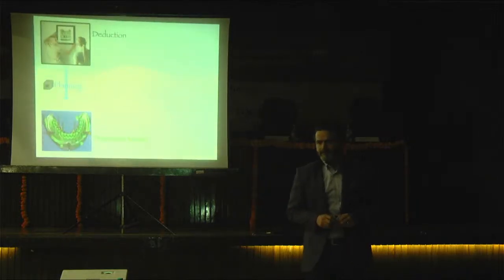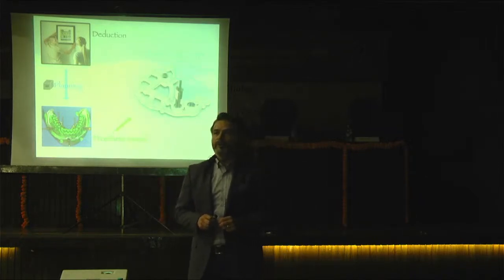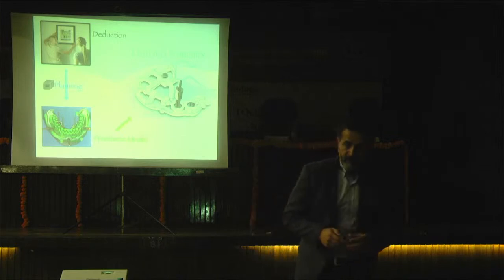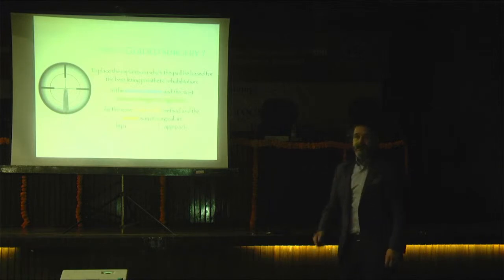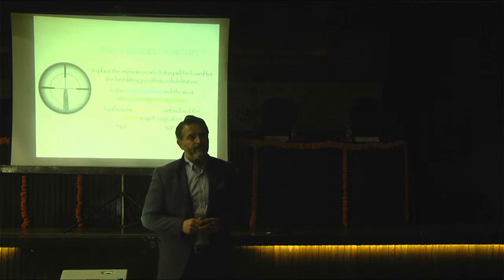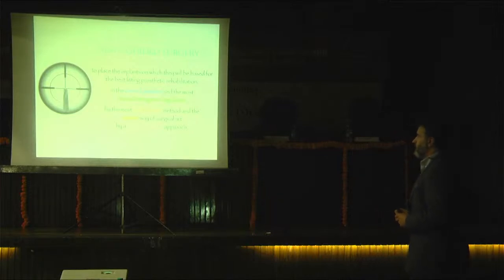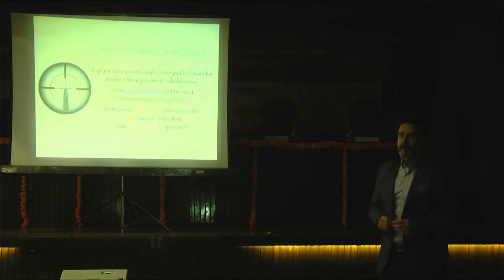To make the long story short, deduction means planning, and planning means the prosthetic model in prosthodontics. And finally, with the surgery, it is guided surgery. And what is guided surgery? Guided surgery is to place the implants, on which the best fitting prosthetic restoration will be based, in the correct position and the most rational emergence angulation, by the most comfortable method and the easiest surgical way, with a patient-friendly approach.